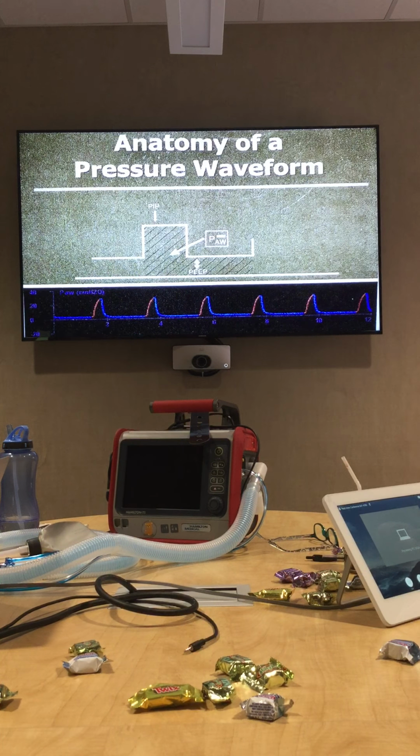The reason that's important is that when we're talking about oxygenation and ventilating a patient's lungs, all of this pressure in that area under the curve has an effect on the lung. The longer that pressure is inside the lung, the potential for damage is also there. So if I lengthen that time out, or I increase the space between my inspiratory side, so I increase my peak inspiratory pressure and my delta P tends to be higher, then you're going to increase that MAP.